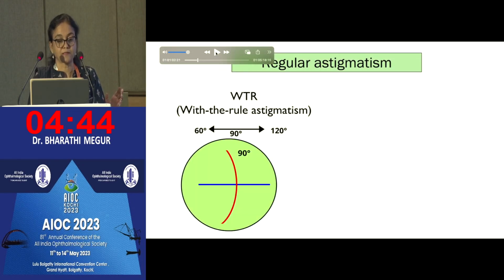So, to conclude from these two case studies, we can now understand that against the rule astigmatism is the commonest incidence, and also that we did not have high-end equipment to incorporate toric IOL in our workflow.